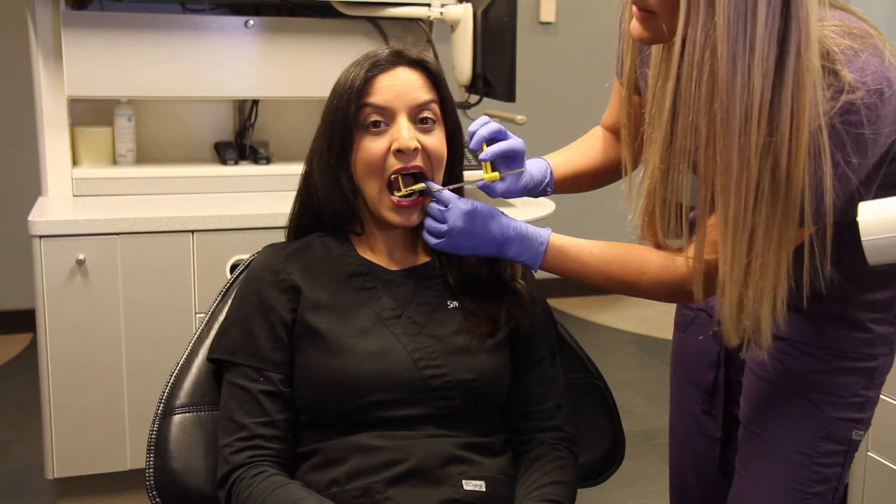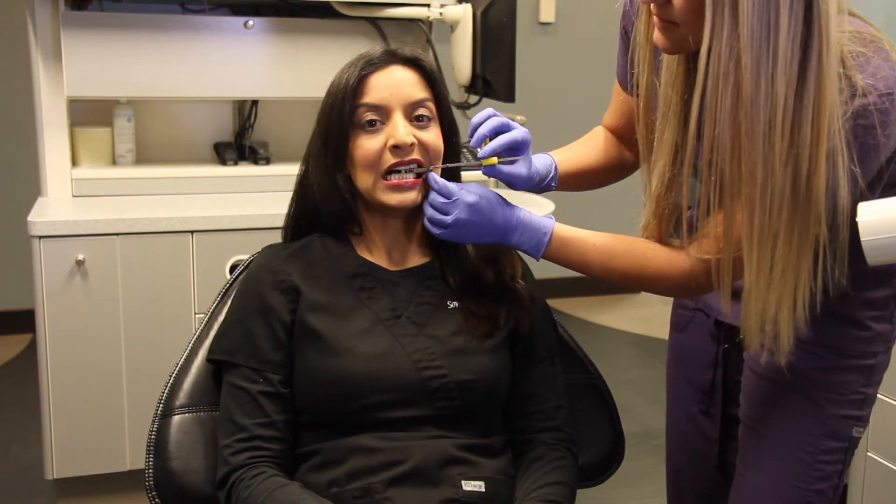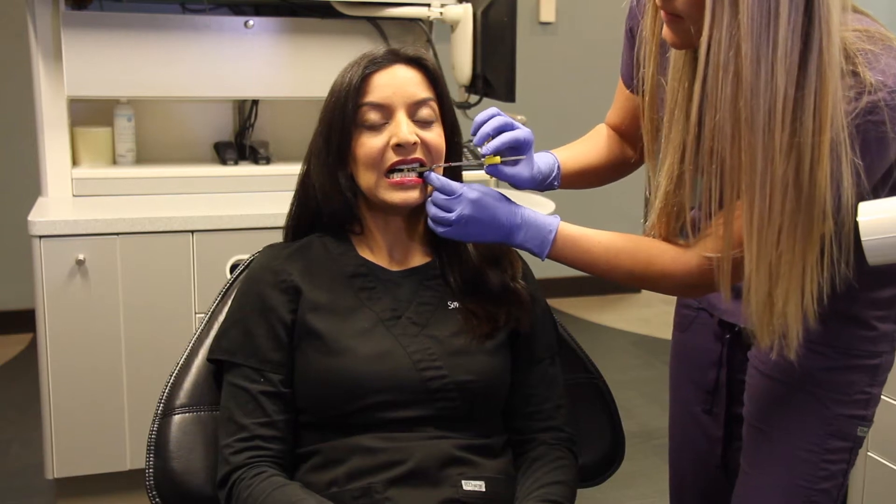When you're first putting the sensor in the patient's mouth, you want to make sure when they bite down on the sensor that there's no flex in that PA. Your assistant is going to want to take a straight angle first. When they go to take the second angle, make sure they make a very strong movement either to the mesial or to the distal of the tooth in order to get another angle.